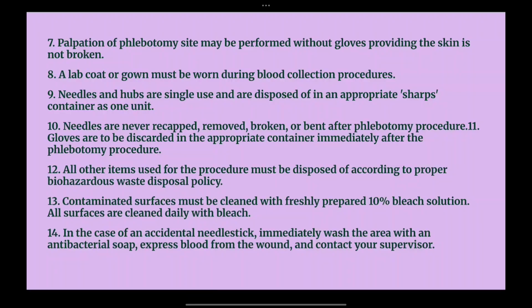The contaminated surface must be cleaned with a freshly prepared 10% bleach solution. All surfaces are cleaned daily with the bleach. The contaminated surfaces, the place where the patient's blood is drawn, should be cleaned with the freshly prepared 10% bleach solution, and cleaning with bleach should be performed every day. After each patient, the contaminated surface should be cleaned on a daily basis, as well as after patient blood if there is a spill on the surfaces.